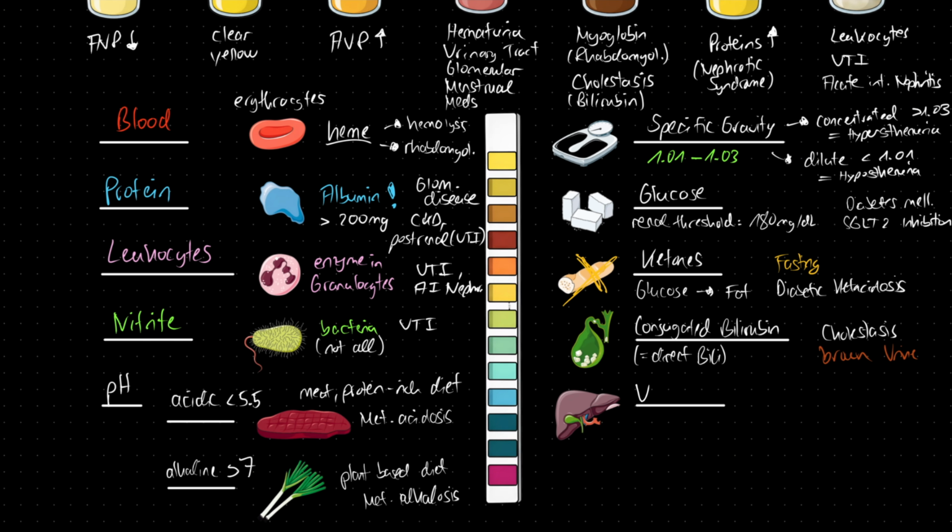And the second marker is urobilinogen, also known as UBG. It is produced by intestinal bacteria from conjugated bilirubin and is partially reabsorbed into the bloodstream. UBG can become elevated in liver disease when the liver can no longer metabolize it efficiently. The underlying physiology is a little more complex, so we'll cover this in another video. So now it's time for you to quiz yourself.